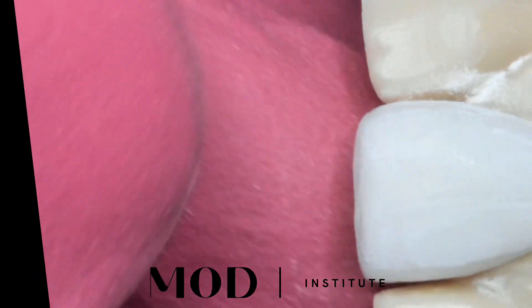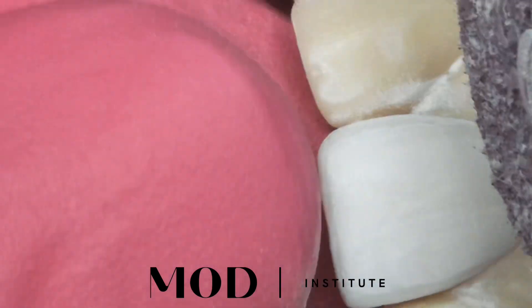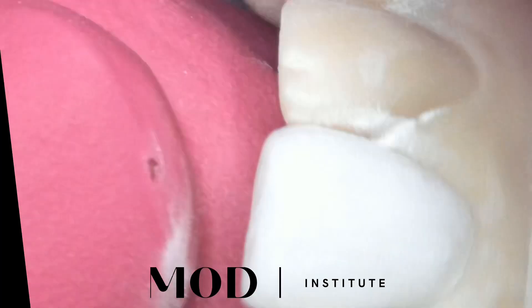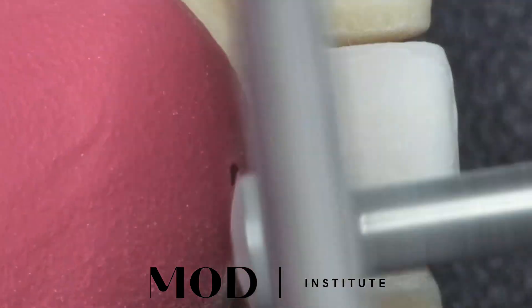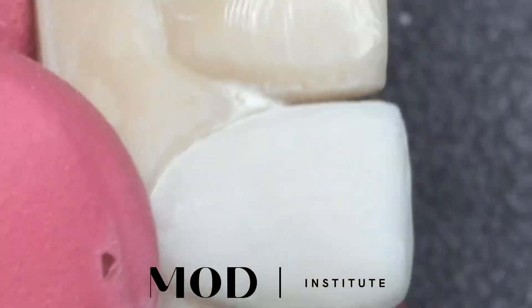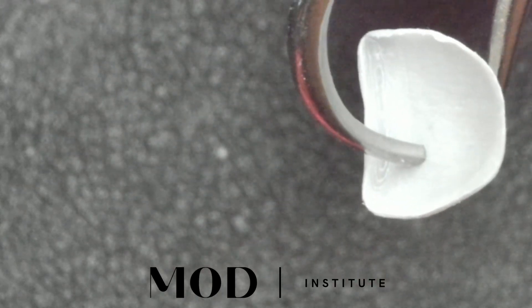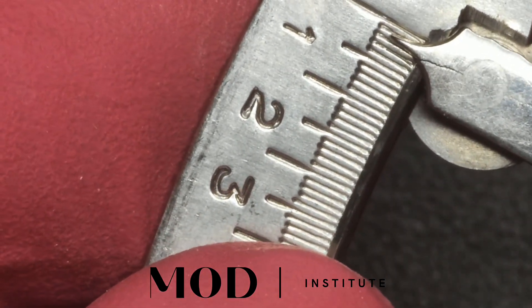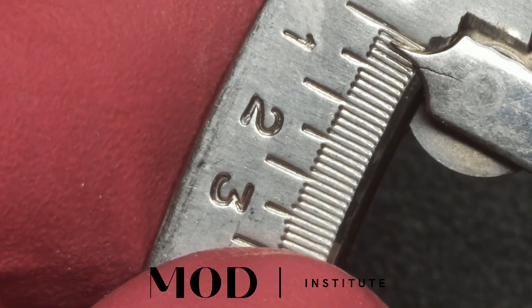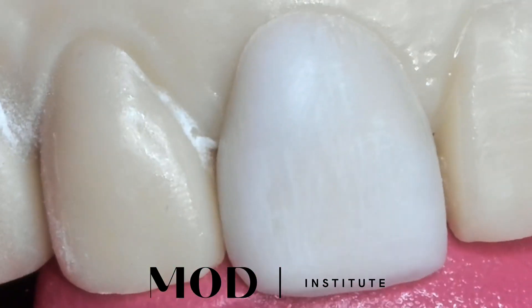What you're going to be doing is creating an ultra thin skin — like a whisper thin shell of a veneer — that is going to make even cases you didn't think you could do additive possible with an additive technique. This is how I've been able to do so many no-prep veneers for my patients, using just 100-200 microns of material. Here we are at about 150 microns. For this particular patient we're going for a pretty big color change, and about 200 microns is kind of the sweet spot for that.